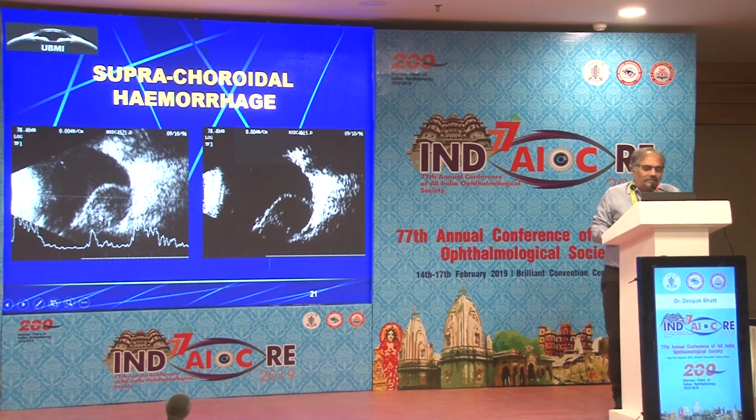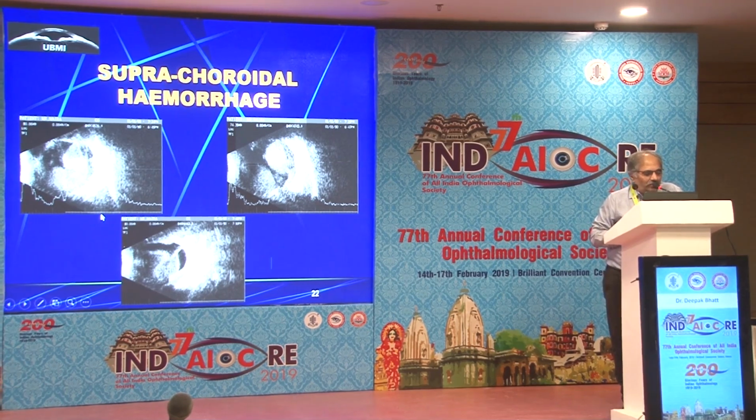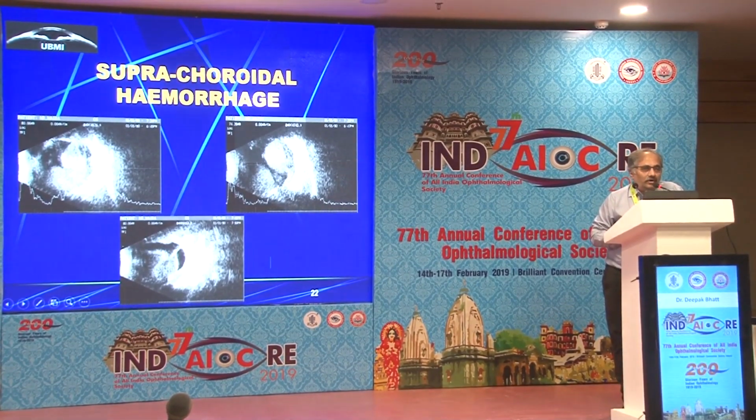So the machine in front of us is of immense help, and one should utilize all the functions of the machine. This was a real googly to me. This was a gentleman around 80 years old, an air marshal in the air force, and he was hypertensive. He presented to me on day 1 something like this. Clinically suspected to be a case of choroidal metastasis.